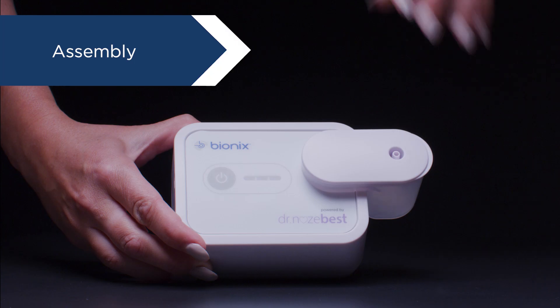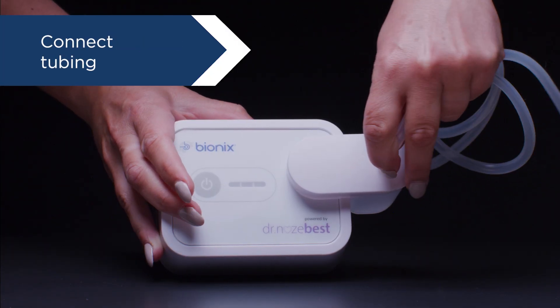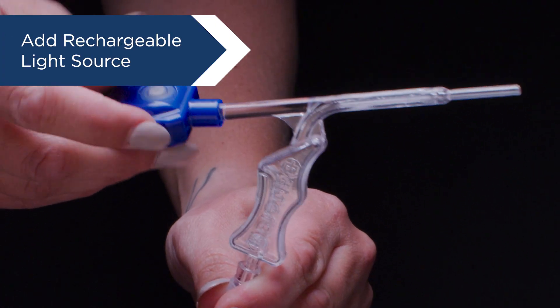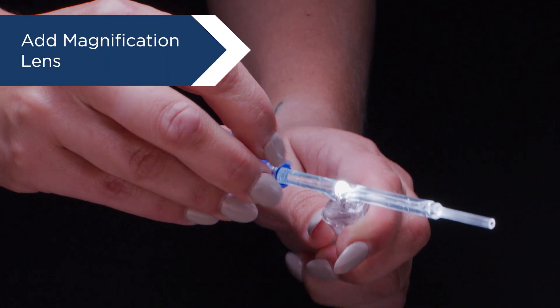Assemble the system in seconds. Attach the cerumen catcher to the suction pump. Connect the tubing to the cerumen catcher and a lighted suction handle. Secure the rechargeable light source onto the suction handle with a few simple turns. Place the magnification lens if desired.